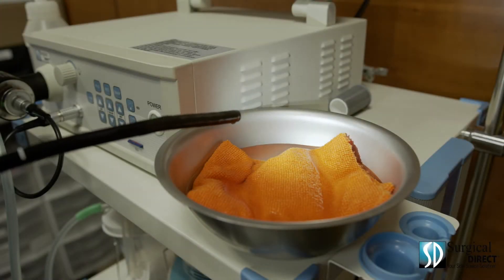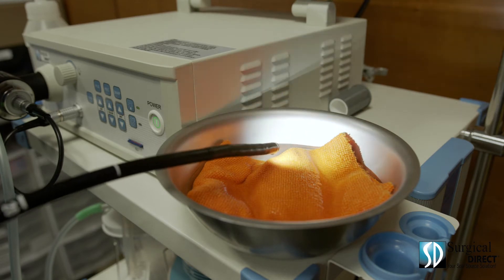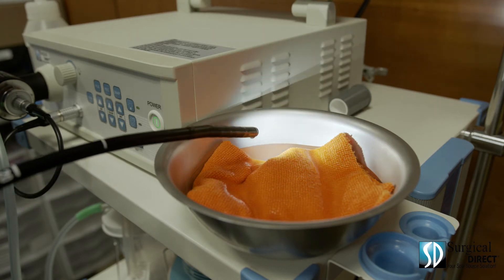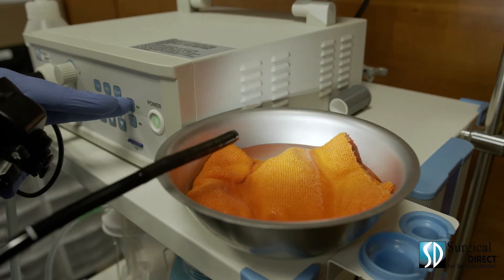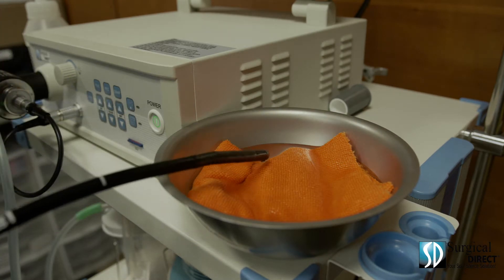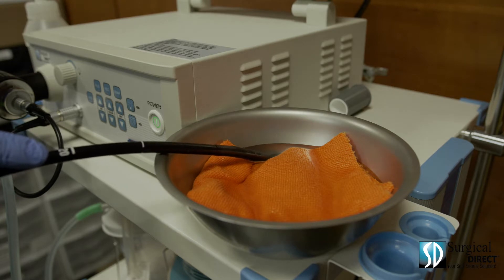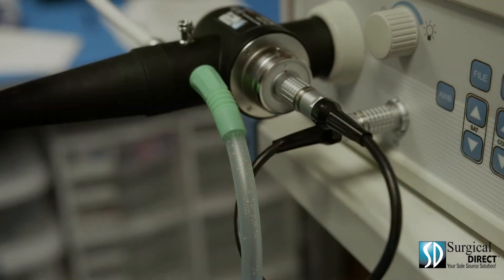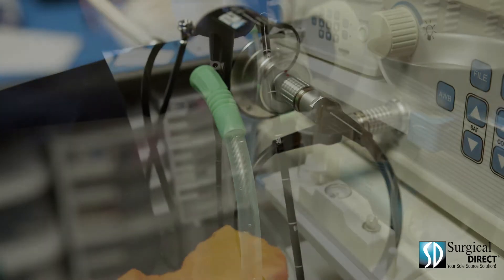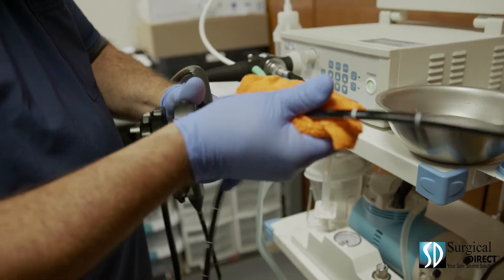At the end of every procedure, it's important to thoroughly clean each endoscope. The channels inside the scope have been exposed to proteins, which can stick to the scope if not properly cleaned immediately after the procedure. Start by turning off the light, then inserting the distal end of the scope into your enzymatic solution. Depress the suction button and suction through all of the enzymatic cleaner. You'll then use your soft rag to gently clean all external surfaces of the scope.